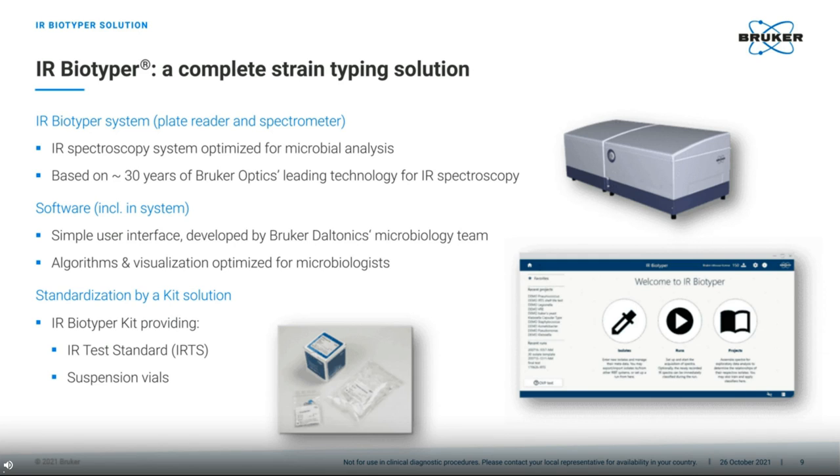We provide some standardization with the kit solution. The kit provides standards, process controls, and lyophilized bacterial cells where differentiation must be seen, but the strains are very close to each other. The suspension vials, which I explained in the slide before, also come with the kit to provide some standardization.